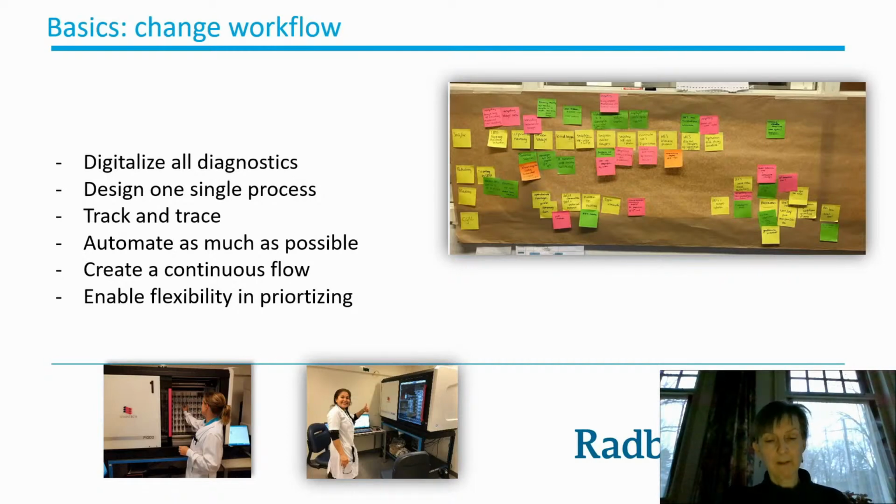And one of the things that we really needed is to automate as much as possible, because we have a limited number of people, limited manpower, and also to make sure that since there are no longer the slides to track things, you really don't lose or mix up cases during the process.